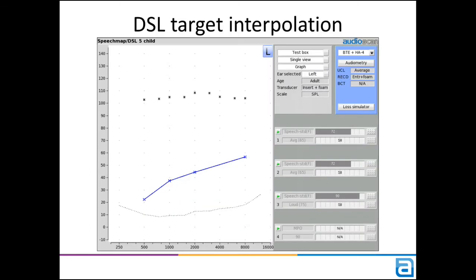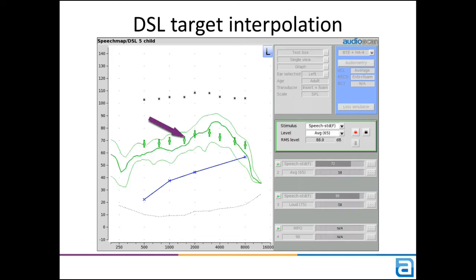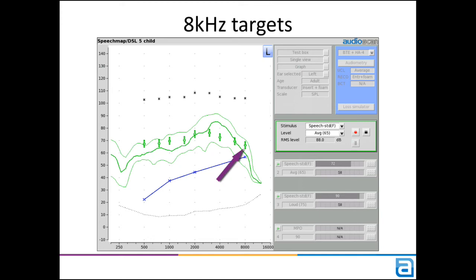Next, we have DSL target interpolation. Previously only implemented in NAL-NL2, target interpolation allows for targets to be displayed at audiometric frequencies for which HL values were not entered. As you can see here, a speech test with an incomplete audiogram will still provide a complete set of speech targets. Also, you'll now notice that DSL is providing targets at 8 kHz, while previously these stopped at 6.